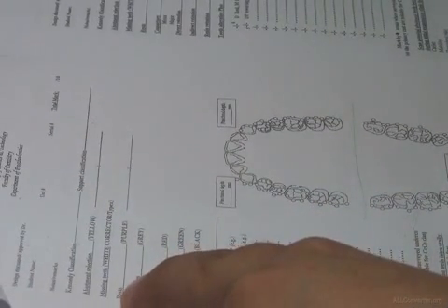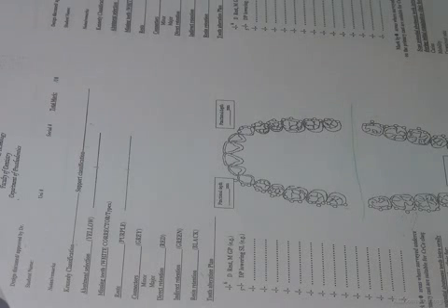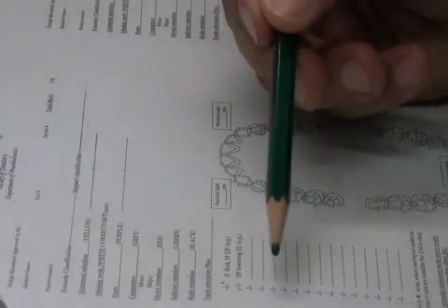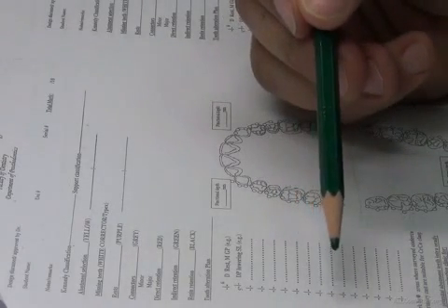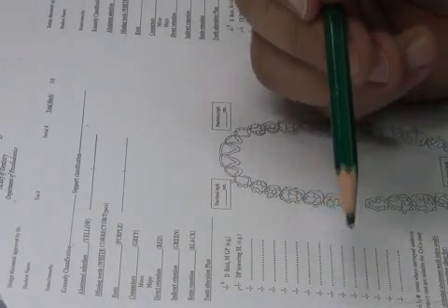Rests are very important to write down. Why? Because we need to know where we're going to place our rests, and rests are not only on abutment teeth; there are extra rests sometimes that we add. So we need to write down the teeth that get rests. When you write down teeth that will contain a rest, that means you're reminding yourself that you should write it down in the tooth preparation plan, because in that section we are planning the tooth preparation.